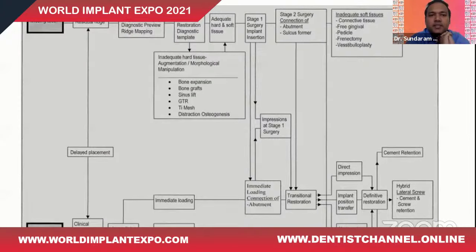Now, this slide presents the grand plan of how an implant treatment is carried out, right from the diagnosis of a missing tooth or a failing tooth, which you see clinically, and the sequence that follows till you place the implant and give the superstructure or final prosthesis on top of it. If you look at this flow chart, there is something known as diagnostic imaging, and it is this diagnostic imaging which we are going to focus upon.